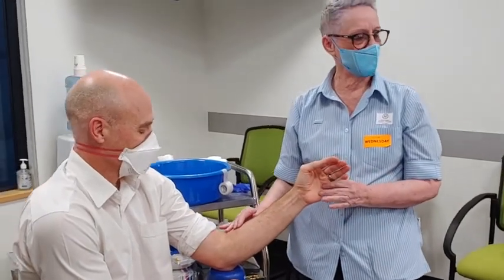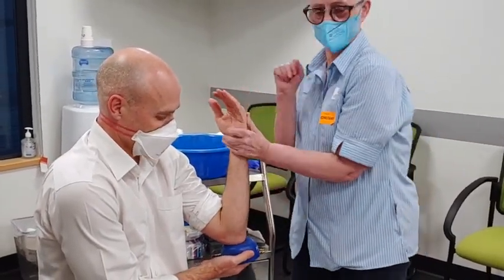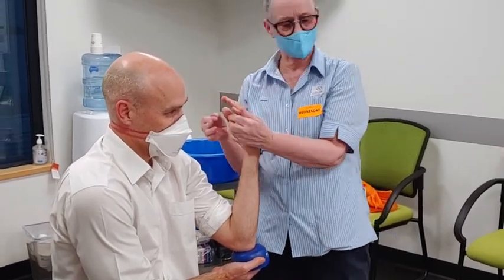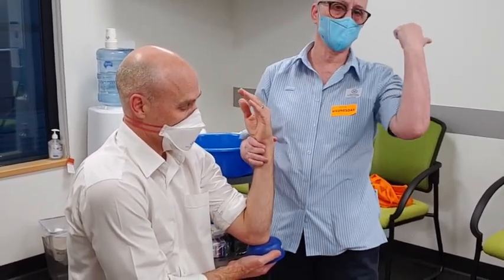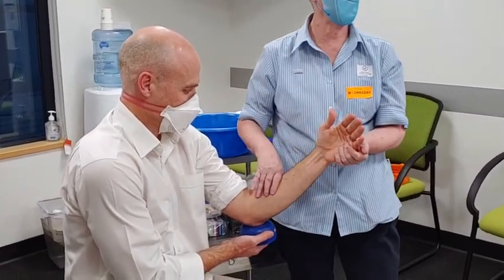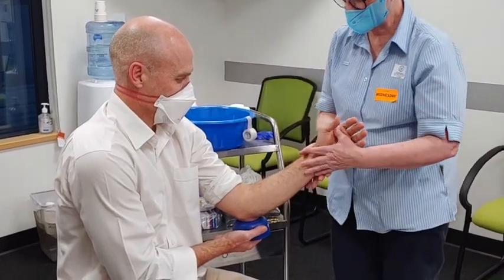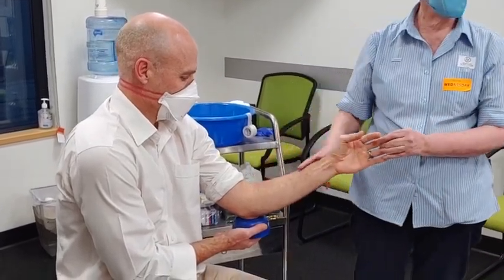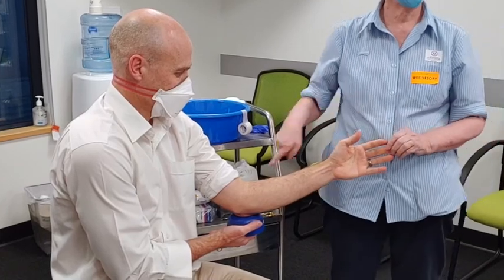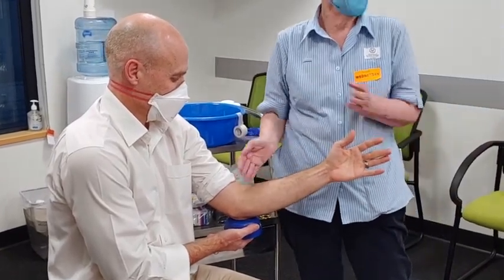The important thing when you're measuring and teaching new people how to cast: a lot of patients come in holding their arm tight, and you're trying to get the cast on and get to the next patient. Try to get them to bring their arm out — it's amazing how that relaxes the muscles. You want the full length of the arm exposed, because when you start measuring your stocking or slab material, you need the right length, otherwise you'll come up short.